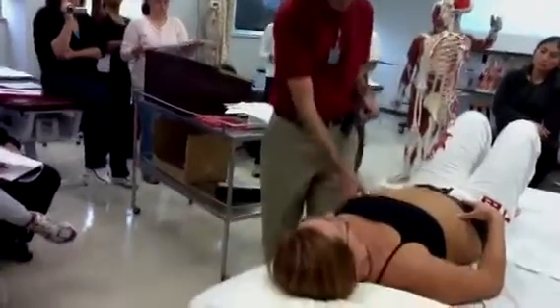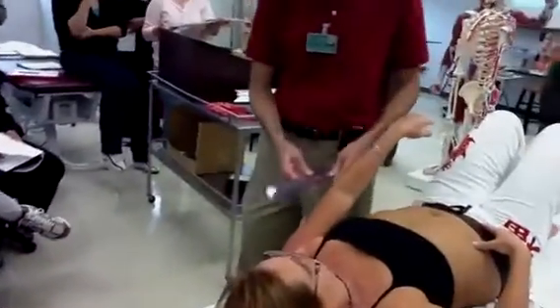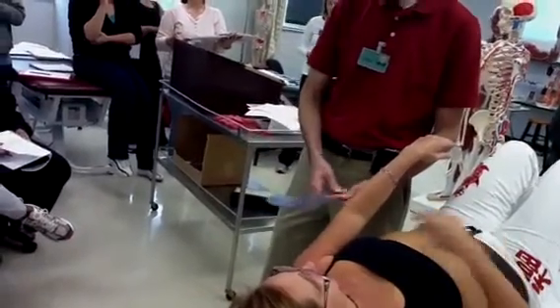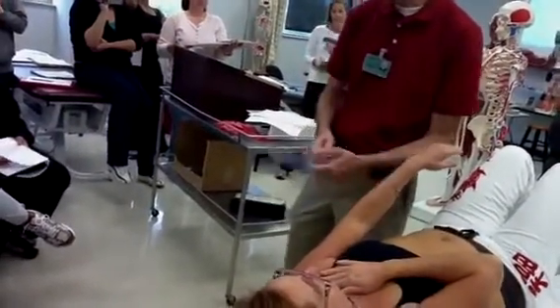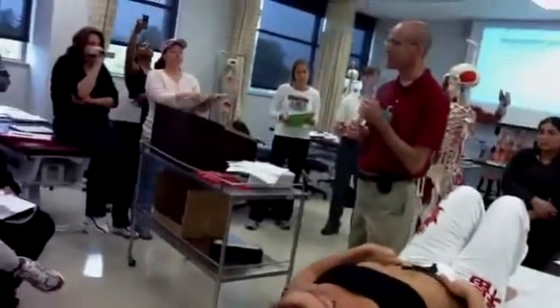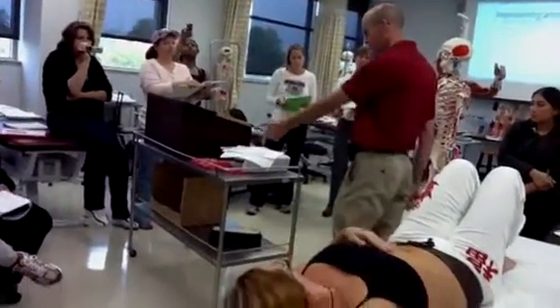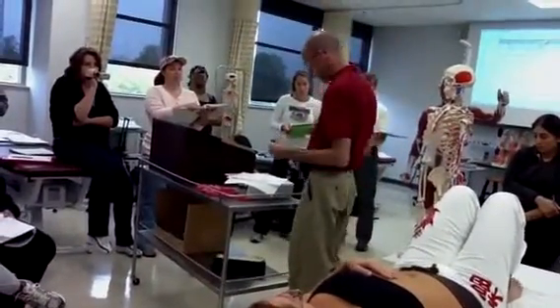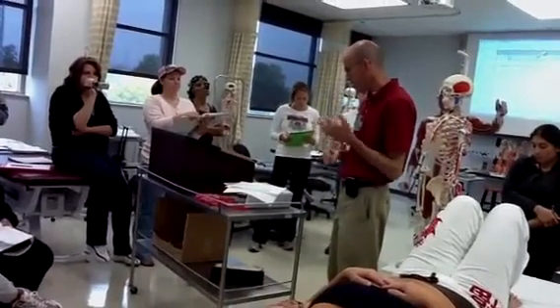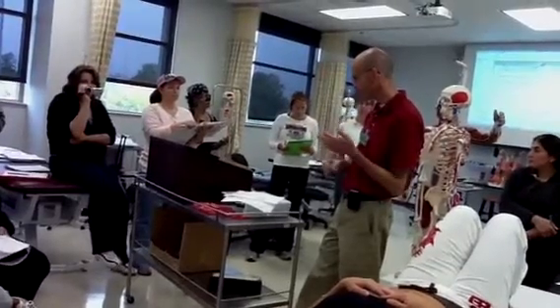So I've also seen it like this, measuring shoulder flexion, and the person is figuring out. I feel bad. It's just so simple. So what helps avoid that sort of thing happening on the skills test? Practice. Practicing, right. Because there's no surprises. You know exactly what you're going to be tested on. Okay, so any questions about the goniometry part of the skills test?